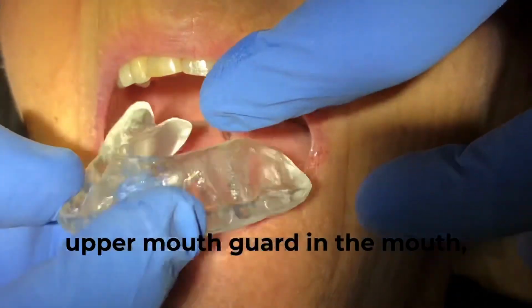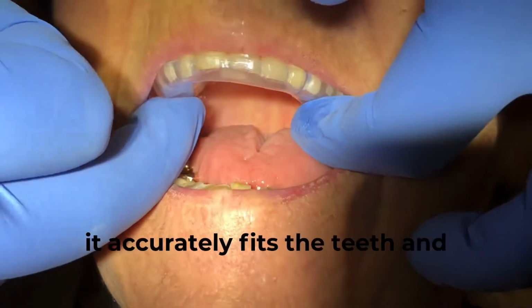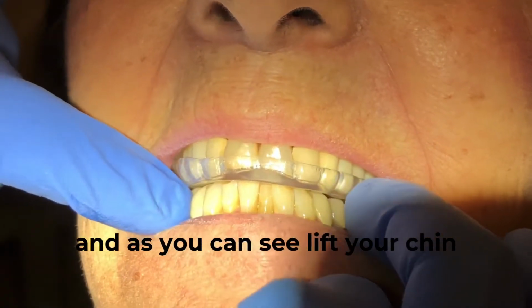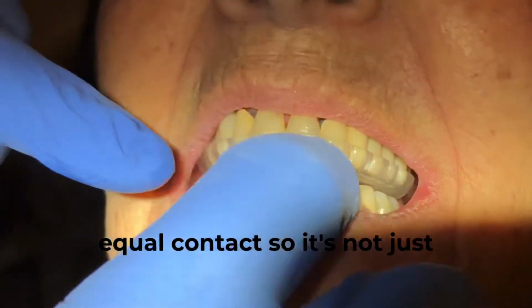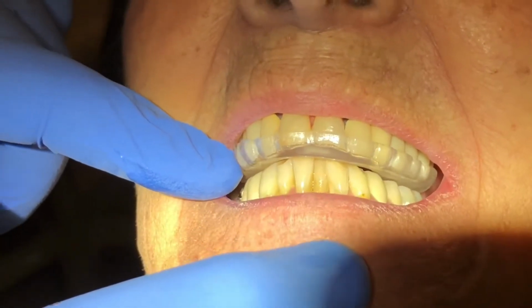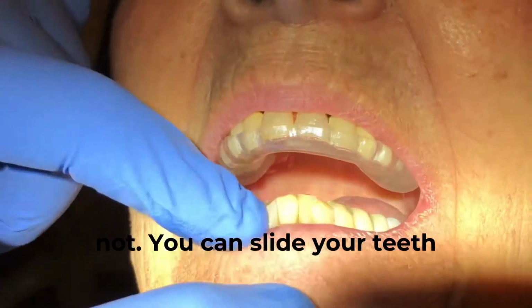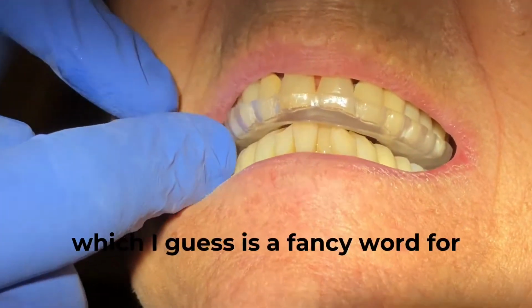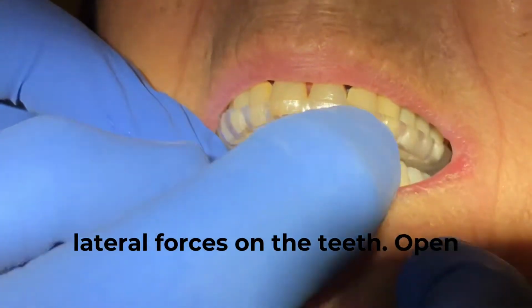So placing this upper mouth guard in the mouth, you can see that we take custom impressions for this so it accurately fits the teeth, and placed it up, and you could bite down. Lift your chin up a little bit. What I'm looking for is for the teeth to touch equally all the way around, so there's equal contact, so it's not just heavy on one side or the other, and that's very important. The goal is that when you bite up and down, you can slide your teeth around on the mouth guard, just grind around. This prevents the teeth from interdigitating, which is a fancy word for the teeth interlocking together, so it doesn't exert any lateral forces on the teeth.